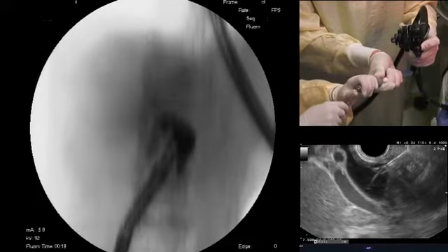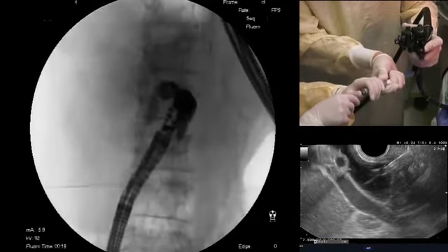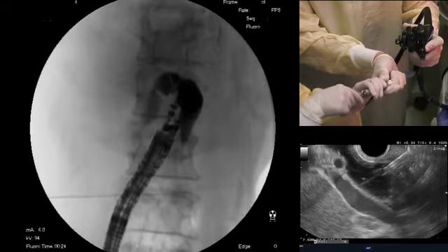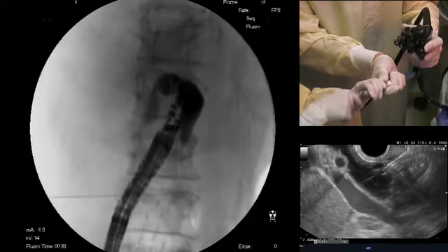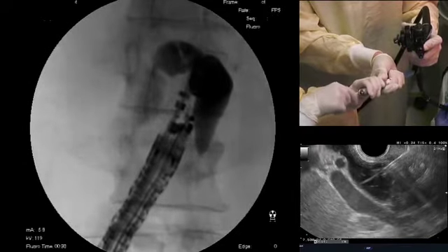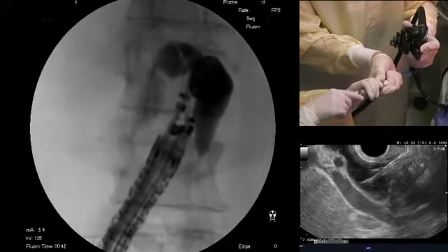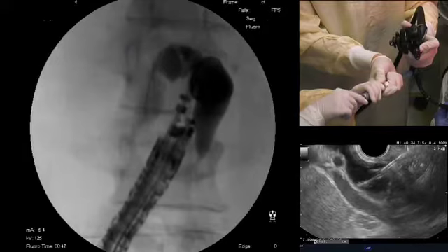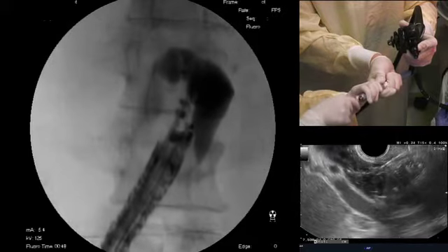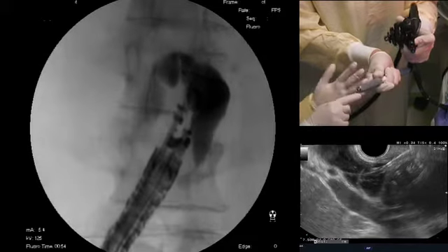It's still going downstream. This would be perfect for a rendezvous, but it's completely obstructed. You can see when the wire goes the right direction — it might be going the right direction now. The wire is going into the cystic duct. Trying to pull back. It's actually coiling inside of the bile duct — but that's okay, too. I think that's going to be fine. It just popped up. The wire just — so you can pull back some. This is actually a very nice view on the EUS.